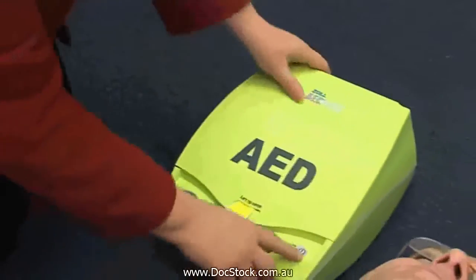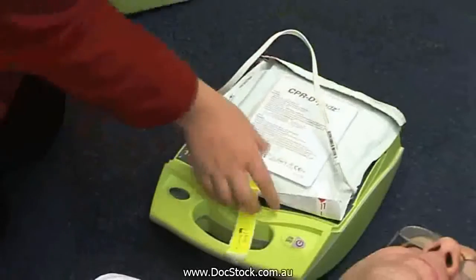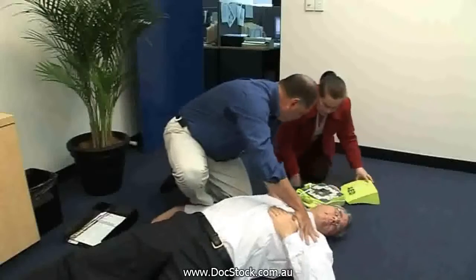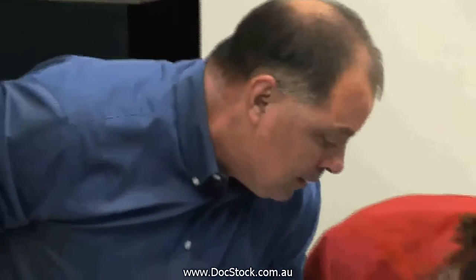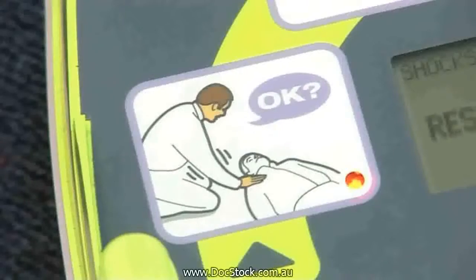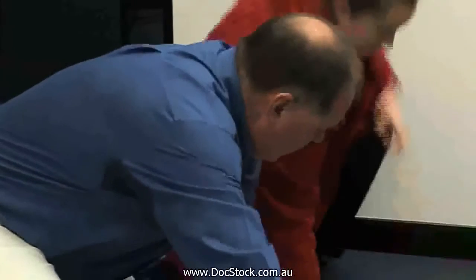The unit is designed to step you through the chain of survival. The first step is to turn the unit on by pressing the power button in the bottom right. The first command you will hear is to check for patient responsiveness. Do this by asking the patient to squeeze your hand or asking, are you okay?